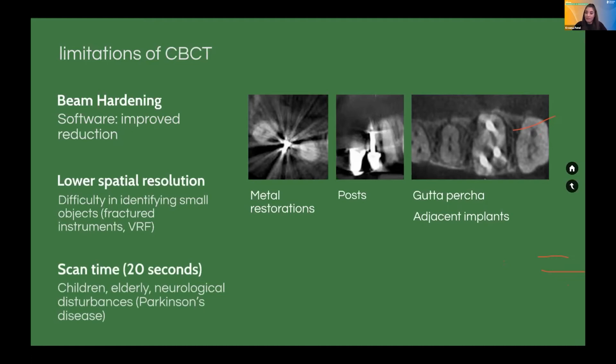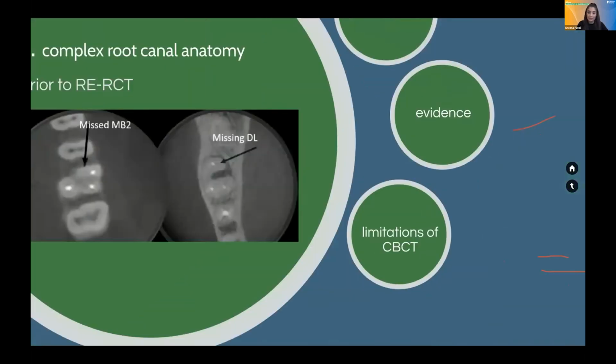Also, the scan time is about 20 seconds, so children may struggle with this, elderly patients may struggle, and anyone with any neurological disturbances may also struggle just being still, because the quality of the cone beam is significantly reduced if the patient moves during the scan.